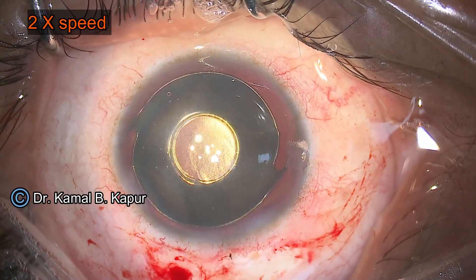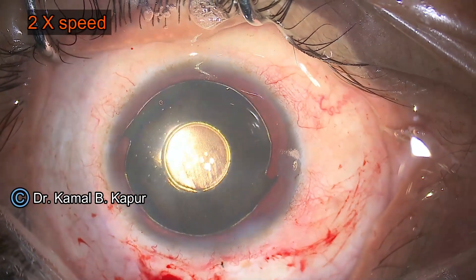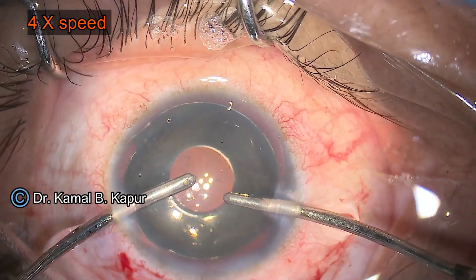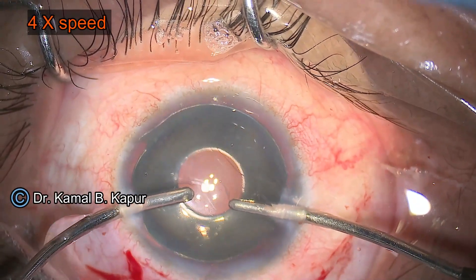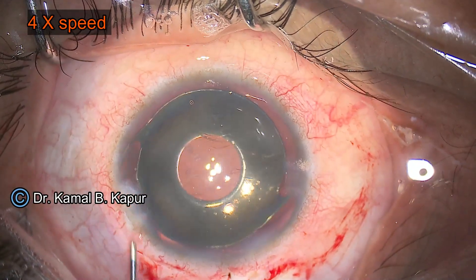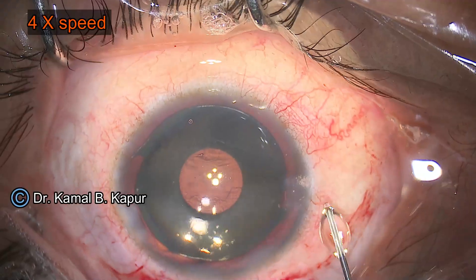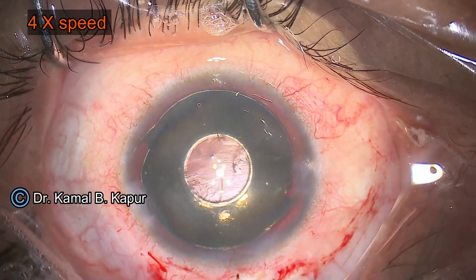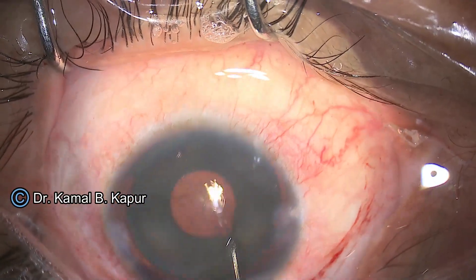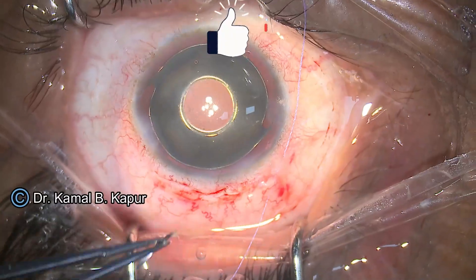We create another side port to do bi-manual irrigation and aspiration of the viscoelastic. Since our main wound has been closed with a suture, we can perform this bi-manual removal of viscoelastic very comfortably. You can see that the lens is absolutely well centered with approximately a 3 millimeter central pupillary zone, and the complete aniridic area is covered except a small peripheral rim.